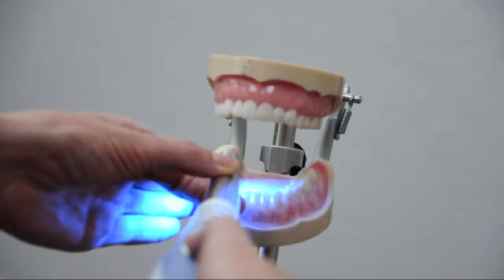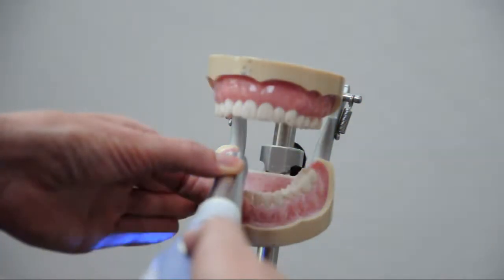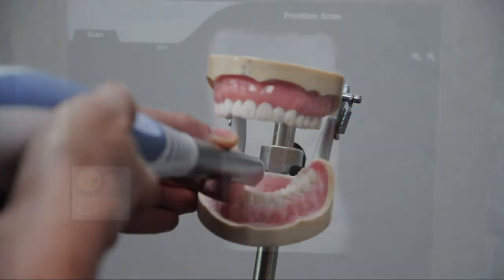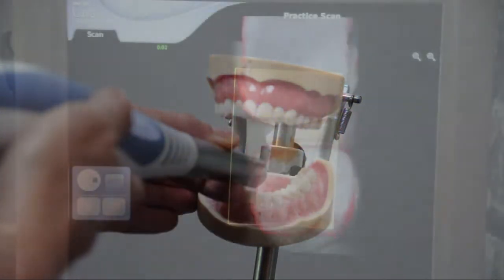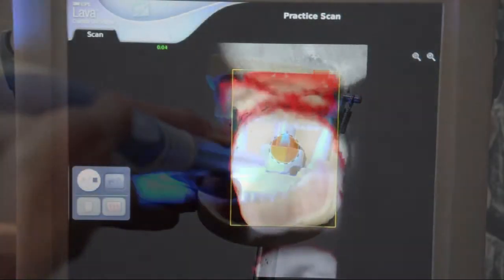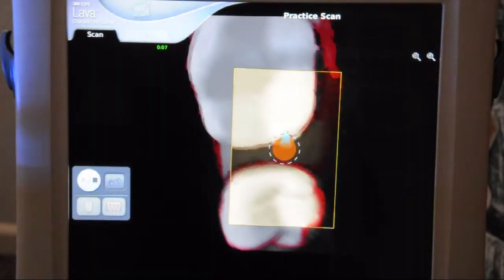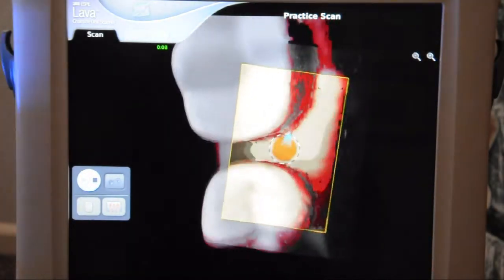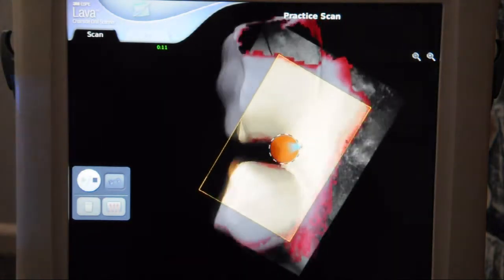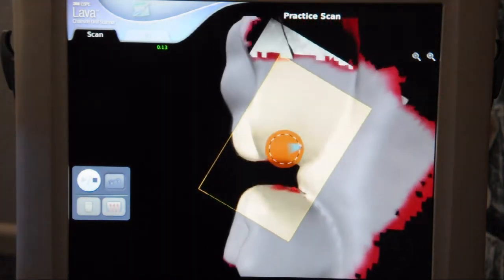As I move the wand over the surface of the teeth, I'm capturing the information. You'll see everything that is going from gray, red, and pink to white is information captured. This is just like taking a video tape, but it's in 3D.